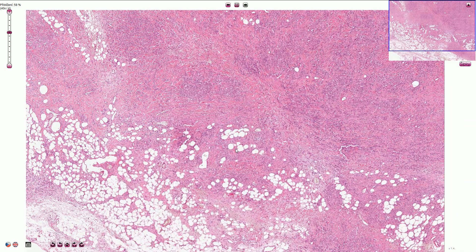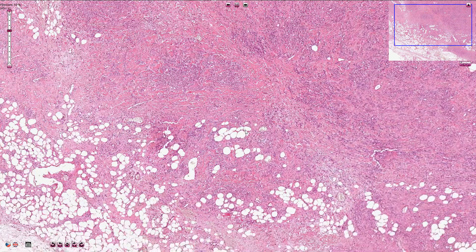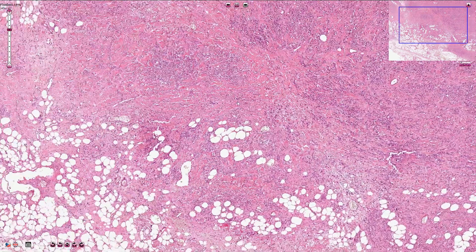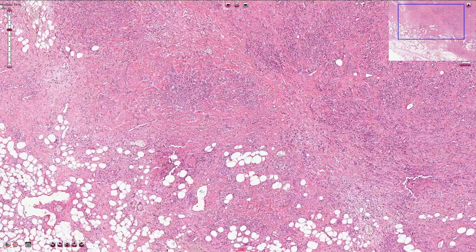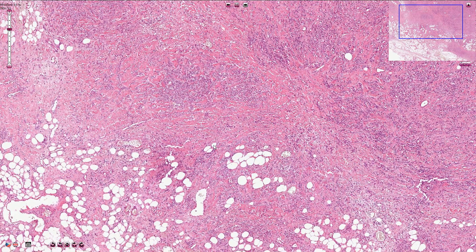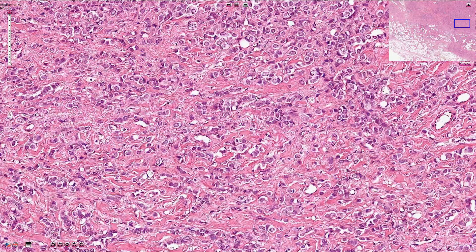Let's go closer to see how the lobular carcinoma actually looks. We can see that the tumor is invasive and it infiltrates the adipose tissue here. The lesional cells are typically arranged in lines, which is also called the Indian file pattern.